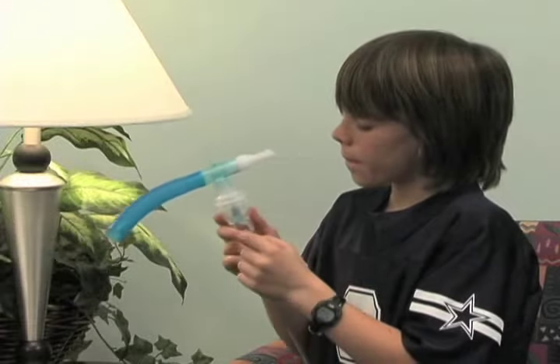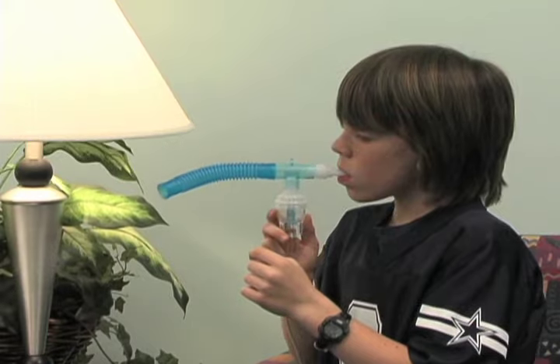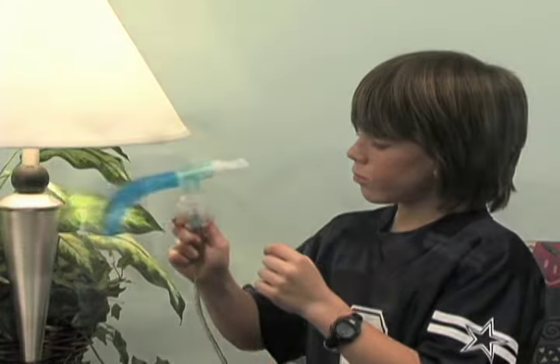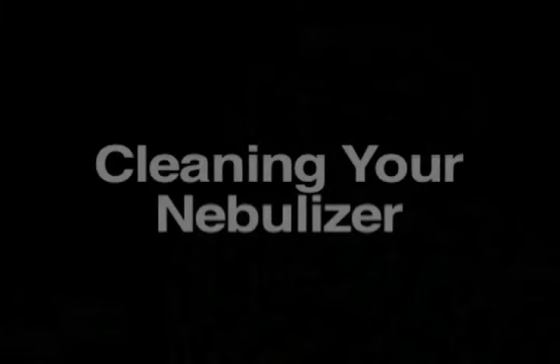When it begins to sputter, shake or tap the medicine cup once or twice. This makes sure all the medicine falls to the bottom of the cup. If it continues to sputter, the treatment is done. Turn the nebulizer off and set aside the nebulizer for cleaning. At the end of the treatment, have your child take several deep breaths and try to cough up any loose secretions.